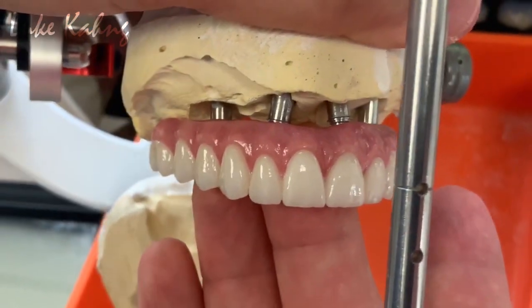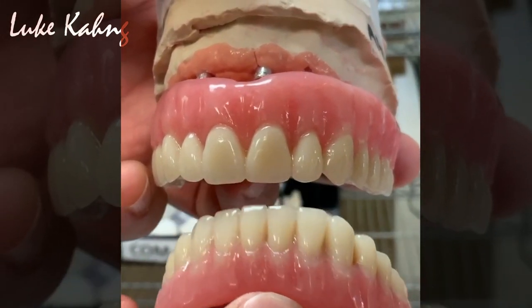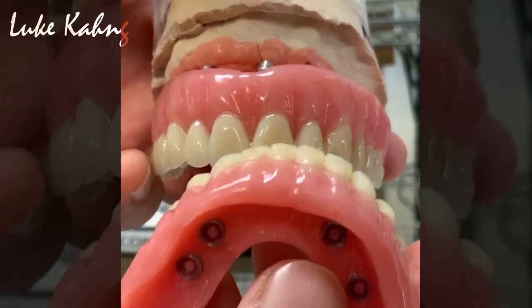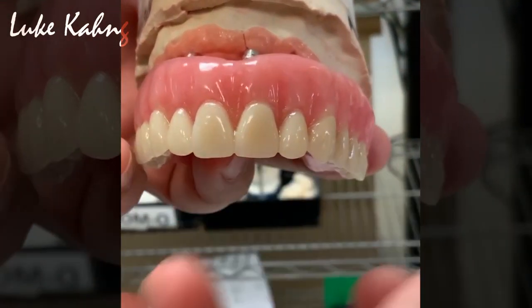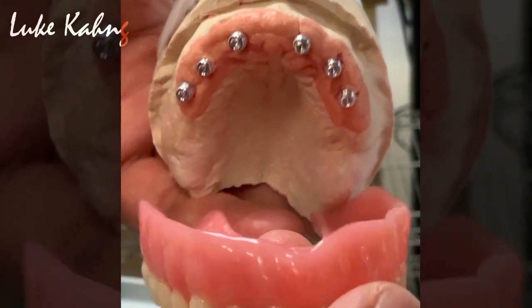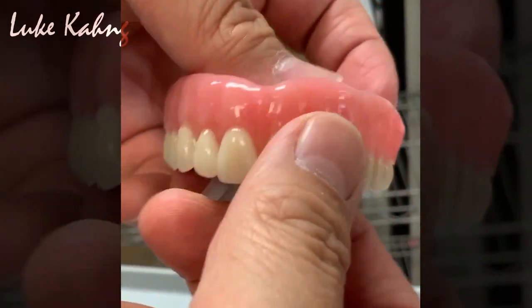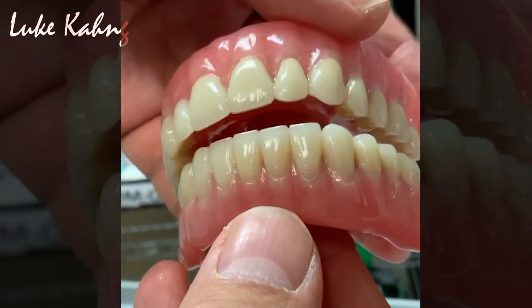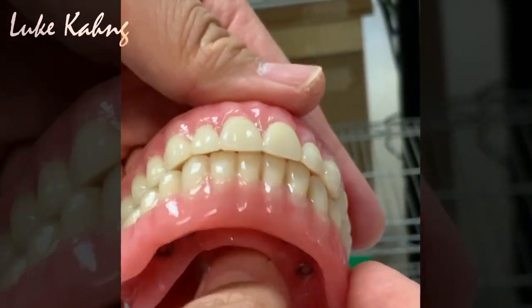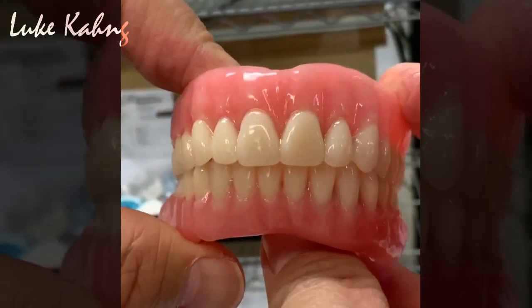Alright, coming up. Alright, so Monday's beautiful locator over denture cases. Finish with the lower boy. Implant, upper, six, beautiful, okay. Now send it to the floater. Beautiful aesthetics, nice job. Alright, so that one is good.